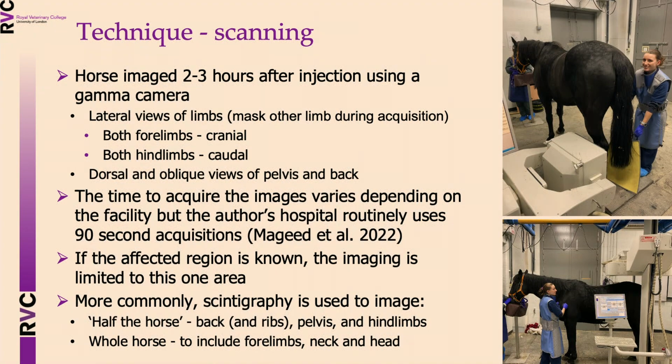The other leg has to be masked for the lateral views.